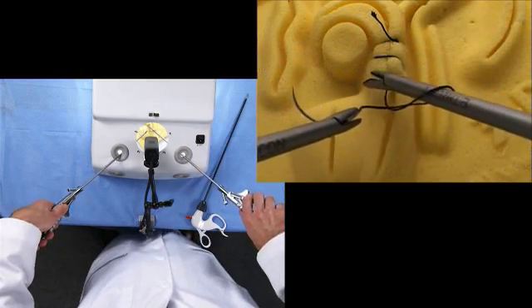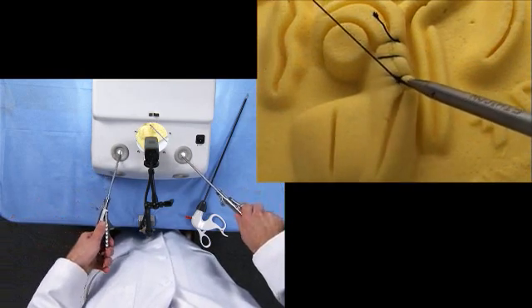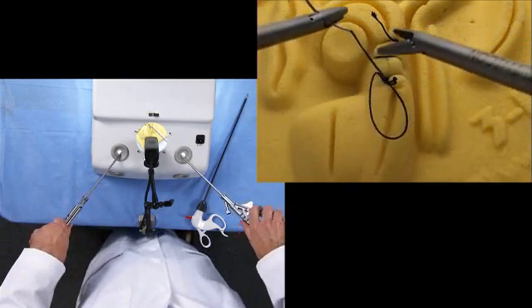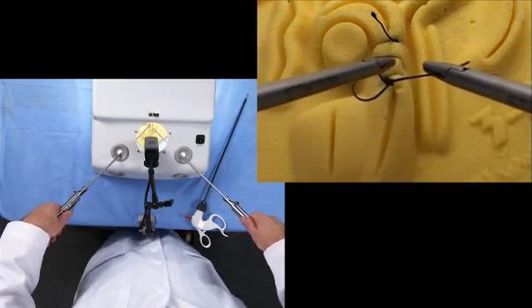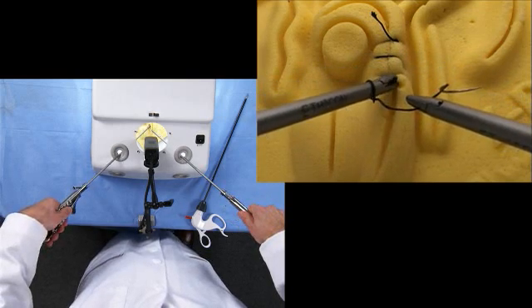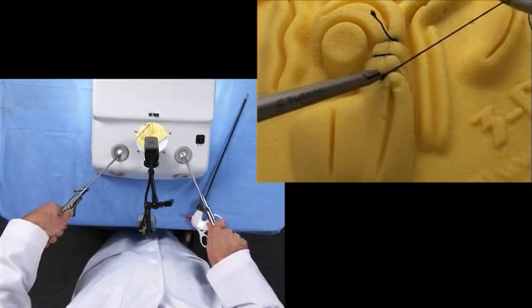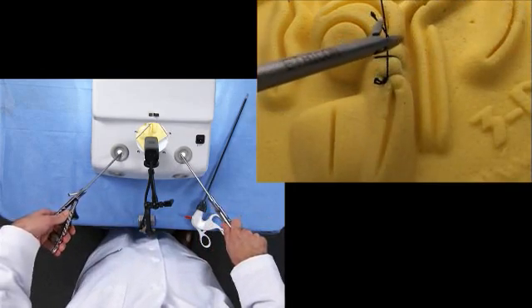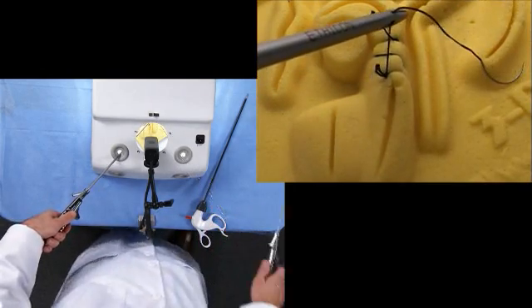Create our camel's hump. Change hands again. Needle to the right of the needle driver. Camel's hump. Grasp our tag. And then we'll cut it.